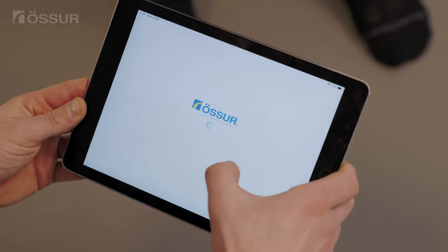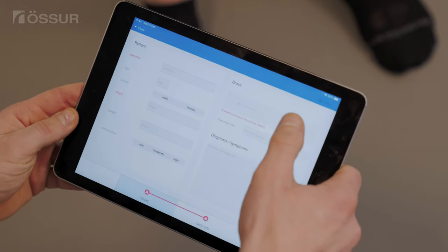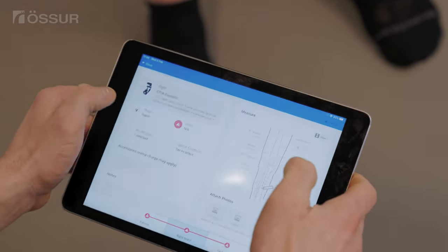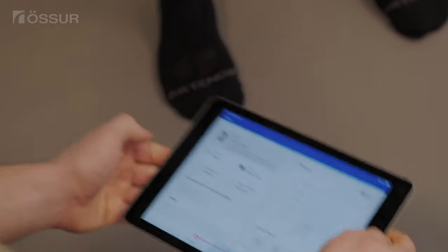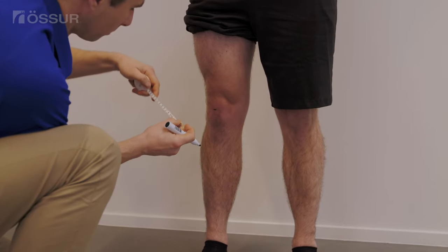The smart measure digital measuring system is intended to make custom brace measuring and ordering more intuitive, efficient, and accurate, with pre-established data fields that ensure critical metrics are recorded. Use a marker pen to apply landmarks on the patient's leg.